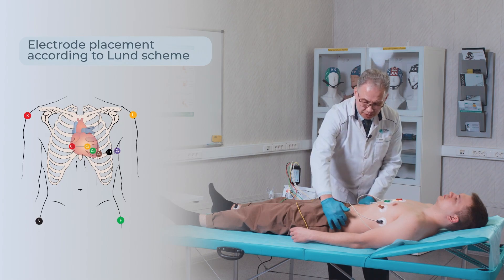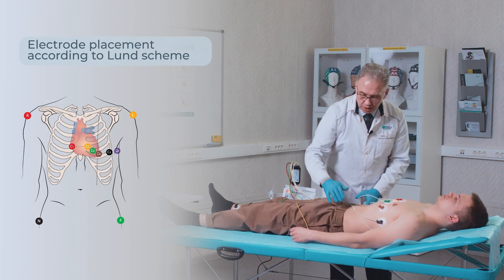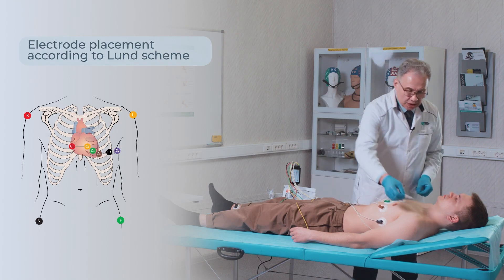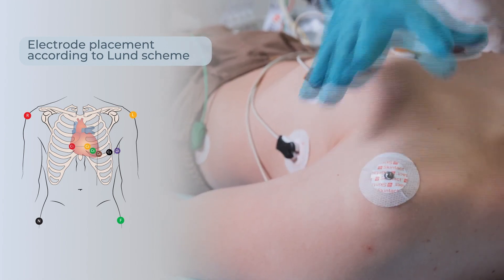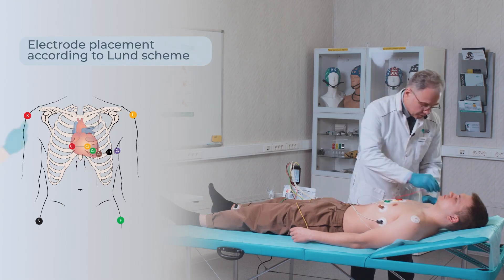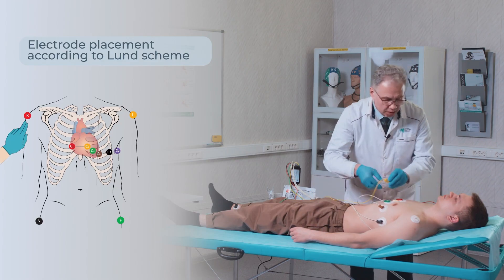In this case, to avoid exposing the patient, we will place disposable electrodes above the iliac crests. Using the advantages of grabber-type clips, we attach the electrodes. We assume the skin is already prepared and move the clips to the corresponding points.